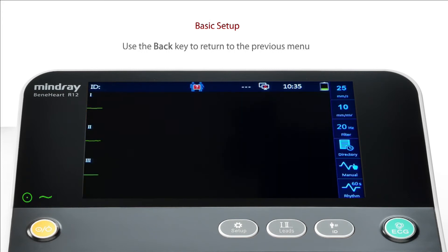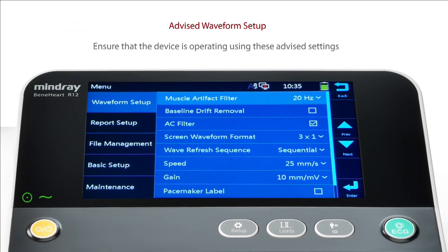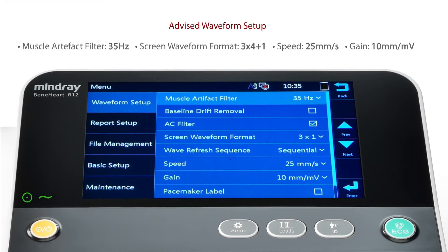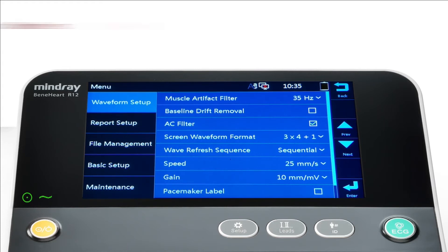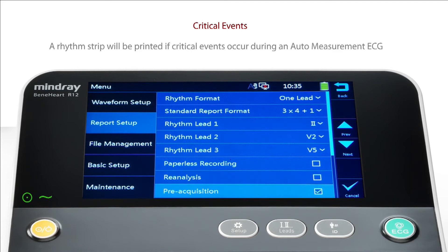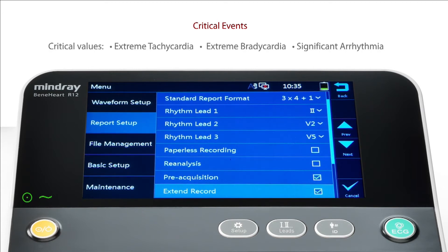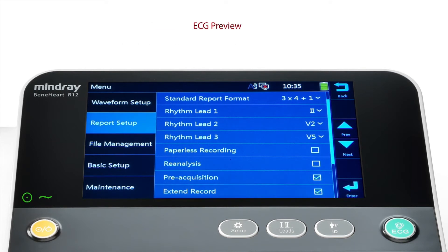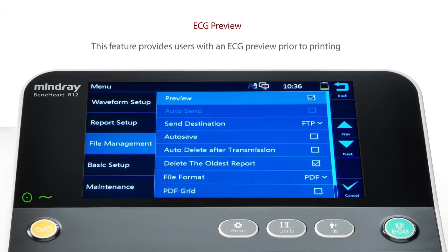Press back to return to the previous menu. In the Waveform Setup menu, ensure that the device is operating using these advised settings. In the Report Setup menu, select Extend Record. This ensures a rhythm strip will be printed if critical events occur during an auto-measurement ECG. Enter the File Management menu and select Preview. This feature provides users with an ECG preview prior to printing and helps ensure ECG paper is not wasted on poor quality recordings.